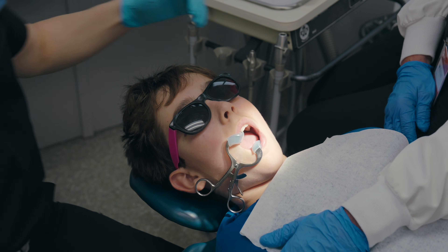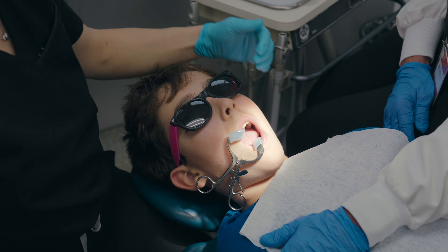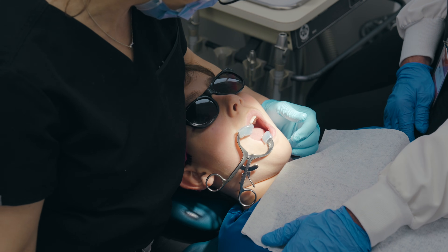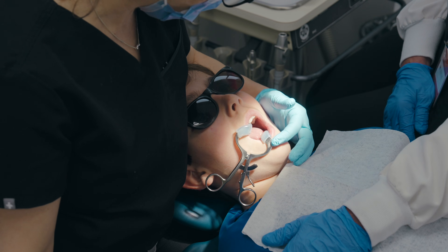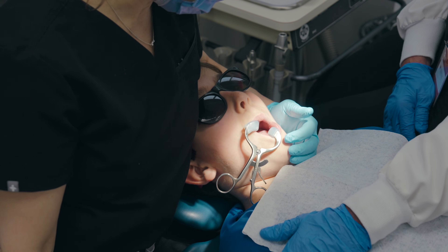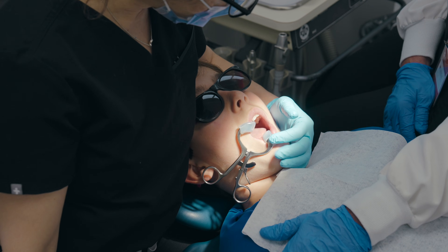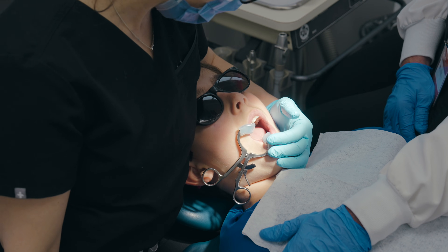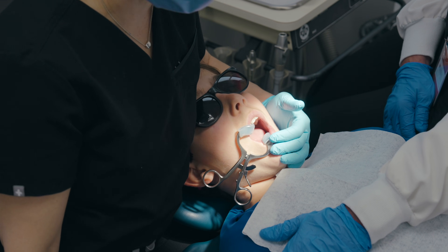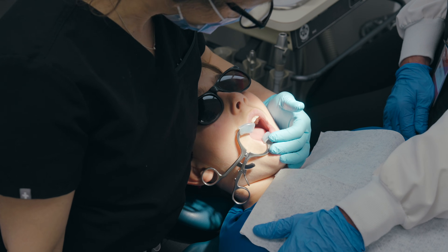This can also be done over the patient's chest with their head and neck extended to keep the syringe out of view. The operator maintains communication with the patient at all times for distraction and to allay any anxiety. Silence to a child can signal that something is wrong, so continue to talk or sing to young patients throughout the administration of local anesthesia.